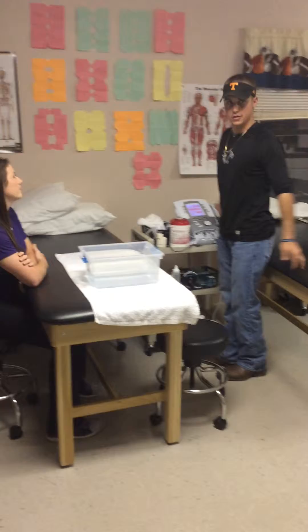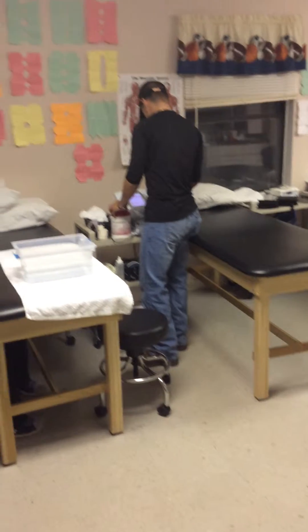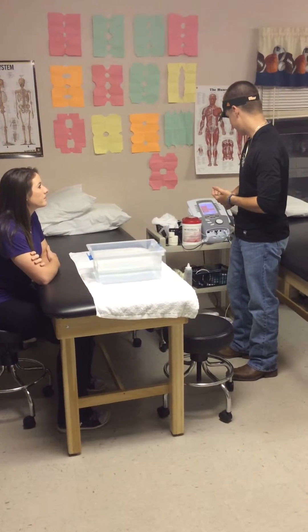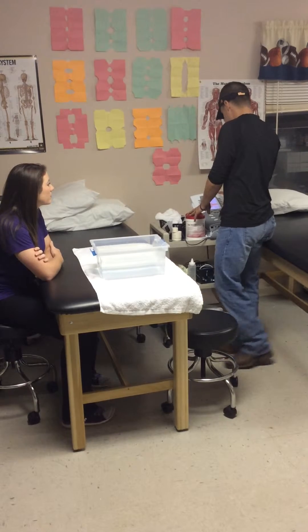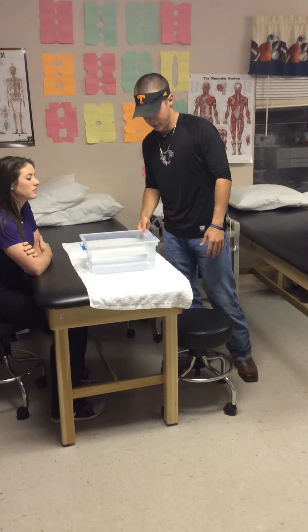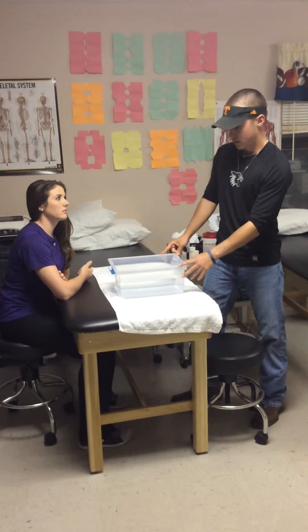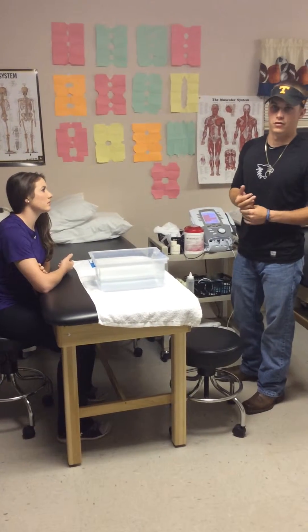First, I will set the parameters on the ultrasound. I will set the frequency to 3.3 megahertz since we are treating a superficial injury such as the wrist. The duty cycle will be set to continuous and the treatment time will be 3 to 7 minutes. The water here is the coupling agent we will be using today, set to body temperature at 98.6 degrees. Also, while setting the parameters, you should set the intensity 50% higher than normal ultrasound.